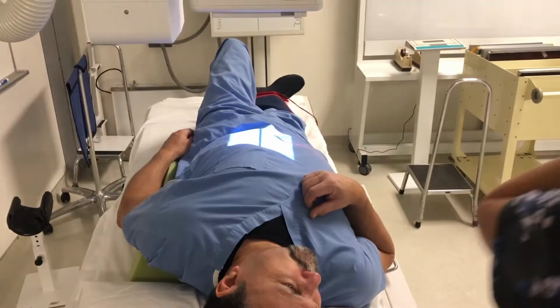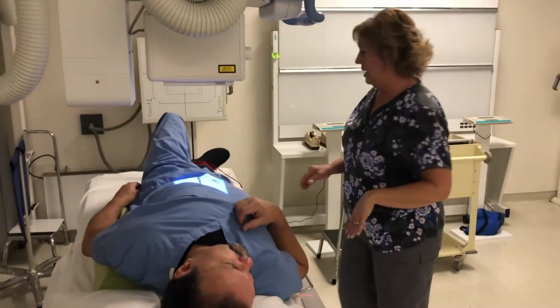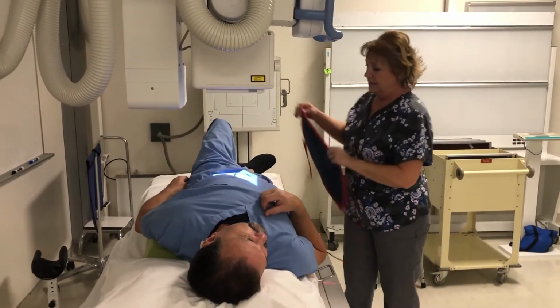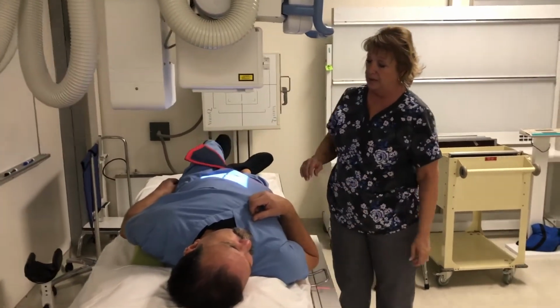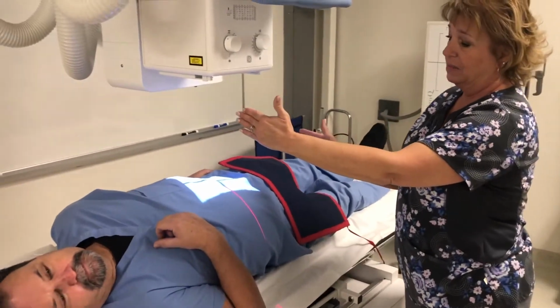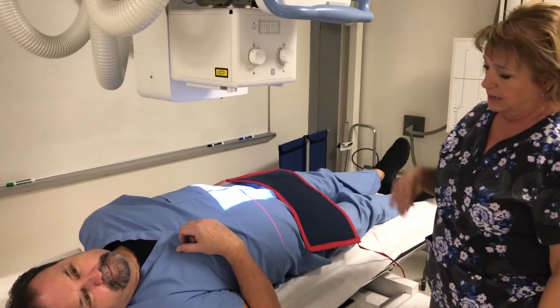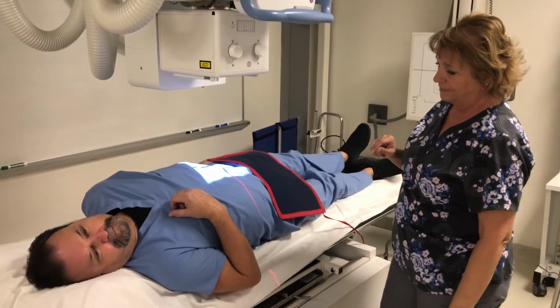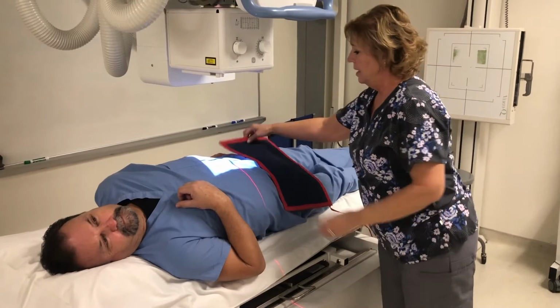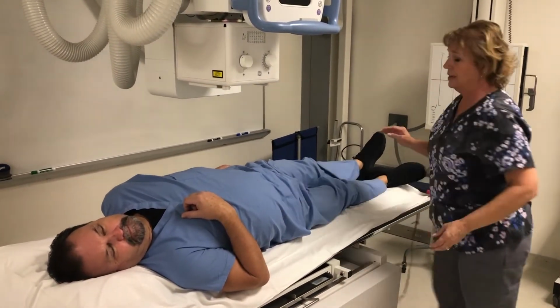So 11 by 14 collimation, 45 degrees to the RPO position. This I could easily shield for. Even on a female you could, because we've decreased our lengthwise collimation here. All right. And he would suspend breathing. Okay. Then I'm going to do this exact same position, but roll the other direction.